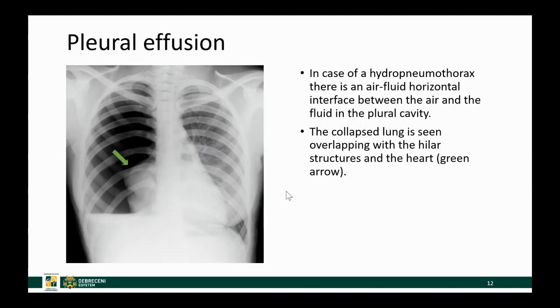This image you have seen before, last week to be more specific. This is a case of a hydropneumothorax, where there is a lot of air and a lot of fluid within the pleural cavity. You see this nice horizontal layer in between the two, and of course the atelectatic right lung as well.